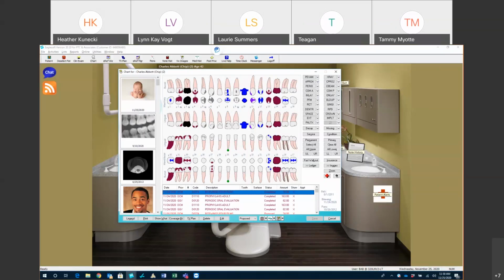Okay, cool. So I'd play around with it for sure. If you have like a Word document with some of these auto note templates, you can kind of pass those around and work on those together. You don't have to be in the office. You guys know how to call each other or set up like a Zoom or something and work on notes together. So that way when you get the Eaglesoft, it's as simple as copying and pasting those in there. So you can do some setup stuff ahead of time. You don't have to wait to get it done.